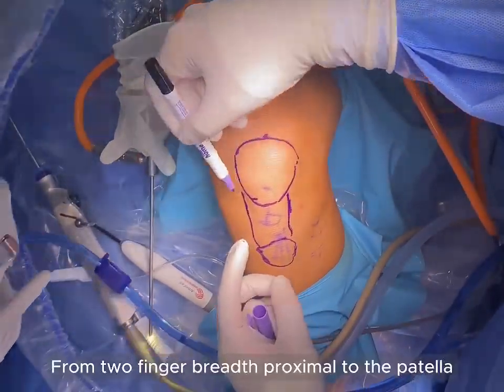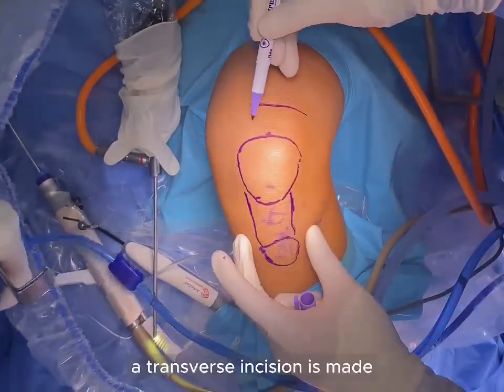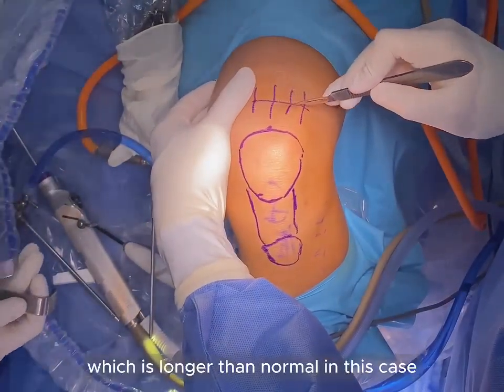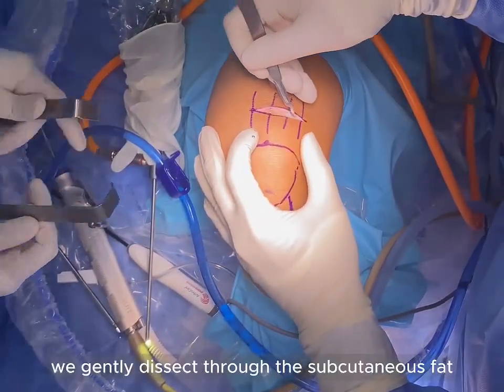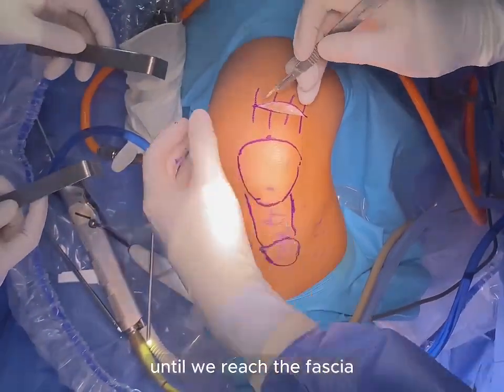From two-finger breadth proximal to the patella, a transverse incision is made, which is longer than normal in this case for demonstration purposes. With the scalpel, we gently dissect through the subcutaneous fat until we reach the fascia.